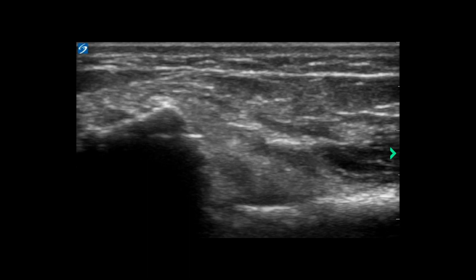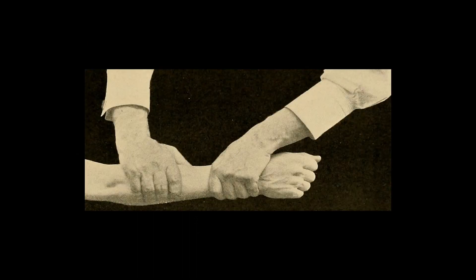Here's one more image of that same fracture from a different vantage site demonstrating that it's a comminuted fracture. Now that you've imaged the fracture you're ready for reduction. Go ahead and use finger traps or a purely manual reduction, or whatever your favorite technique is, and make some manipulation.